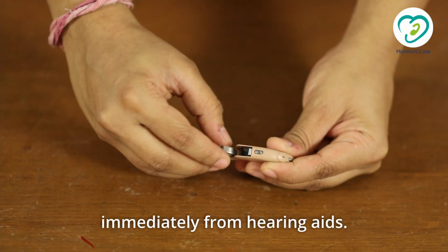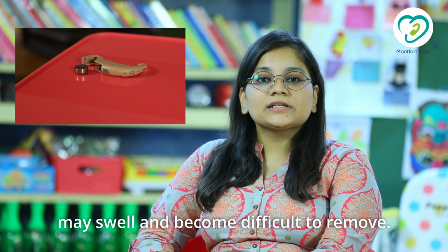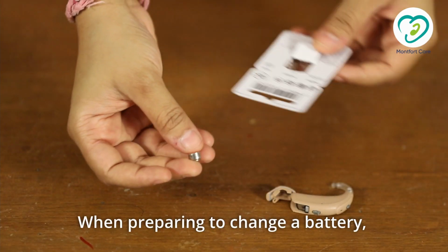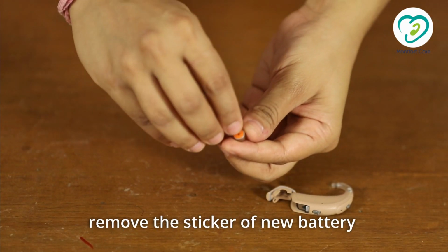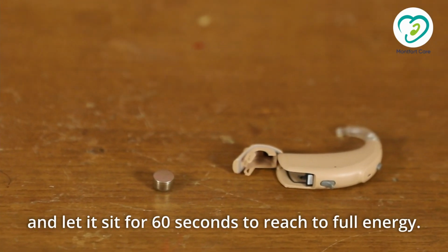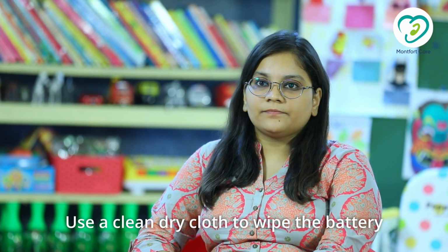Remove dead batteries immediately from the hearing aids. A completely discharged battery may swell and become difficult to remove. When preparing to change your battery, remove the sticker of the new battery and let it sit for 60 seconds to reach full energy. Use a clean, dry cloth to wipe the battery.